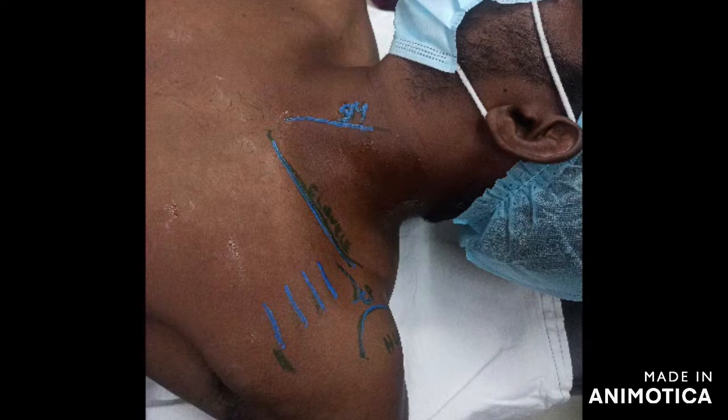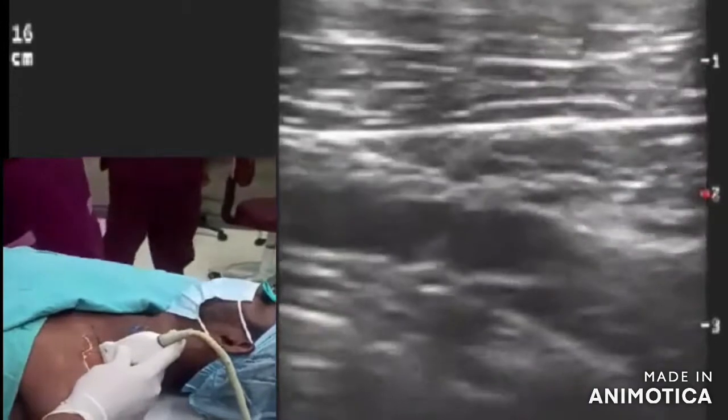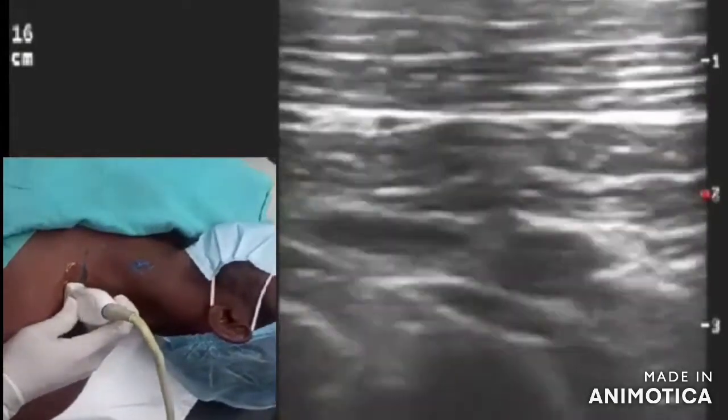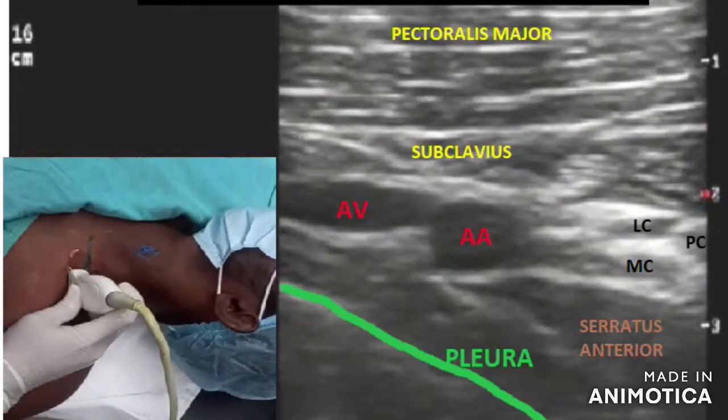Next we get the level of pectoralis minor or the thoracoacromial artery, and as we move laterally it is the lateral infraclavicular view we get. At the clavicle level, scanning in the transverse oblique direction, you can see the pectoralis major, the subclavius muscle, and the lateral, medial, and posterior cords clustered lateral to the axillary artery.